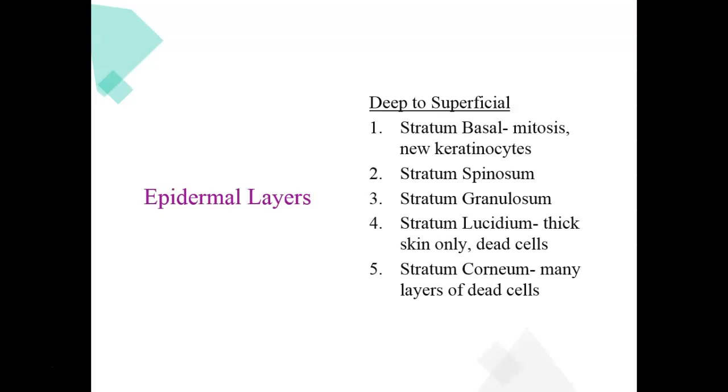So you have little bags. Okay, remember granules are little pieces of something, and they can be contained in vesicles. And when you stain them, it looks very grainy. So you have the granules of the keratin, and you also have other protein products that are created in these cells, and they accumulate in the stratum granulosum. As these cells begin to die, those vesicles and the granules take up a lot of stain. So the stratum granulosum is a thinner layer that stains very dark.